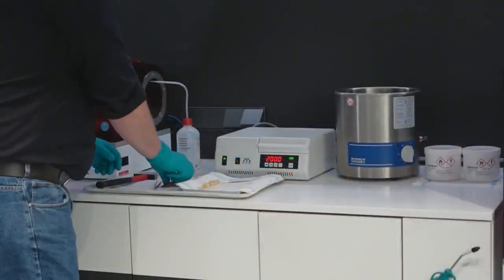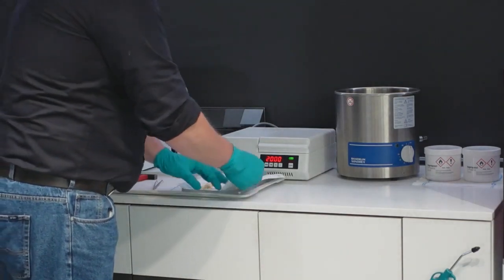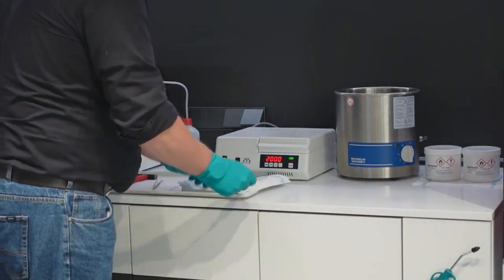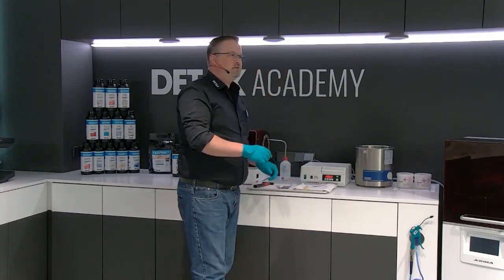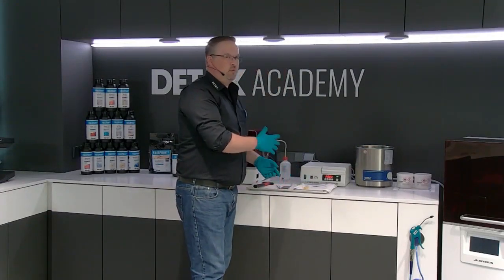The first step, and it is a really important step, we need to blow the rest material from the parts away.